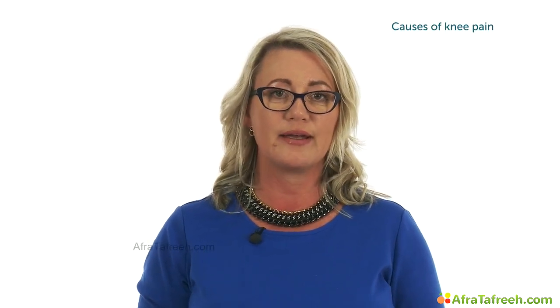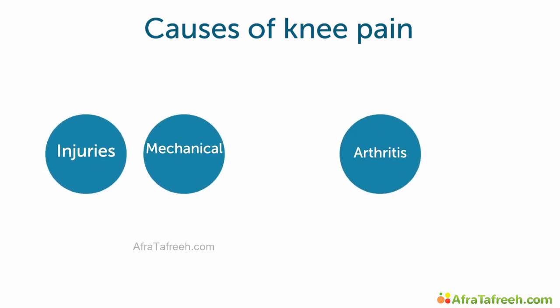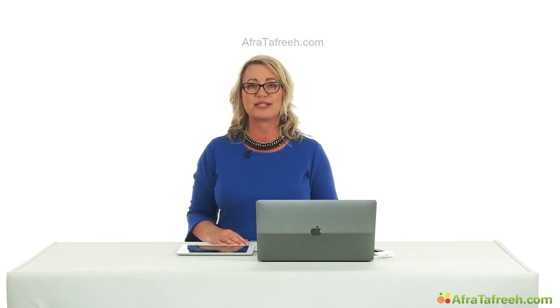Here we have causes of knee pain, which include injuries, mechanical, arthritic, and excessive weight. A knee injury can affect any of the ligaments, tendons, or bursa of the knee, as well as the bones. One of the common signs of a knee injury is knee fluid. The accumulation of fluid can be an inflammatory reaction to a knee injury and can be easily detectable on ultrasound.